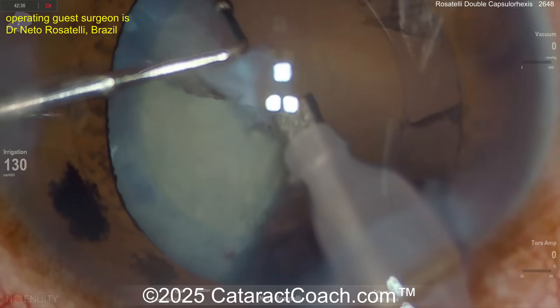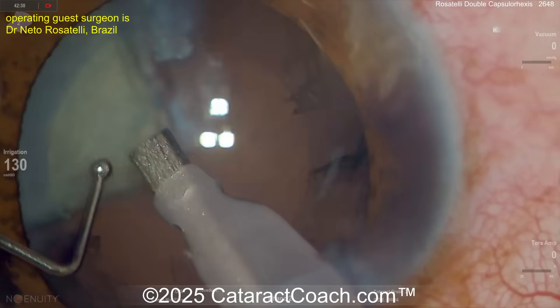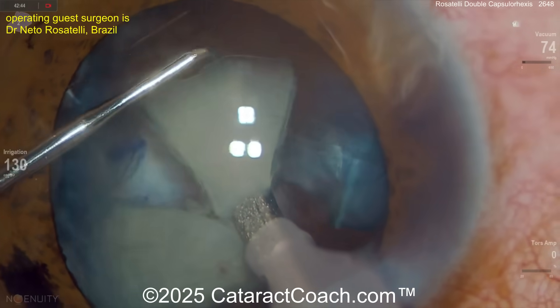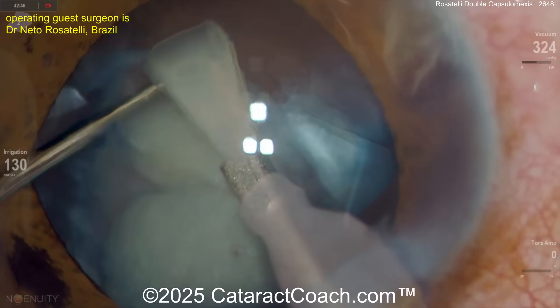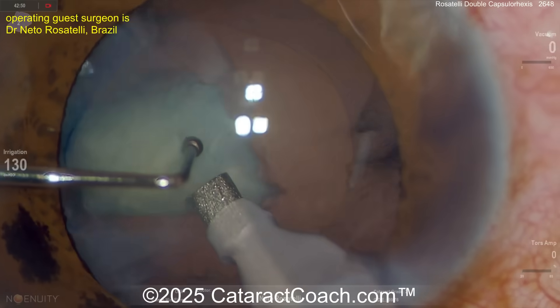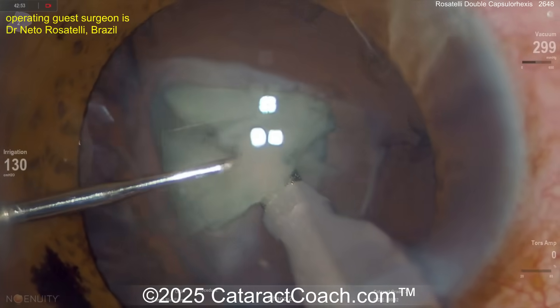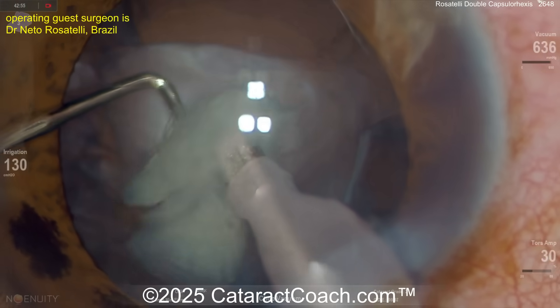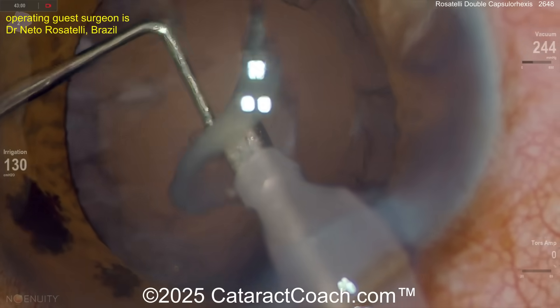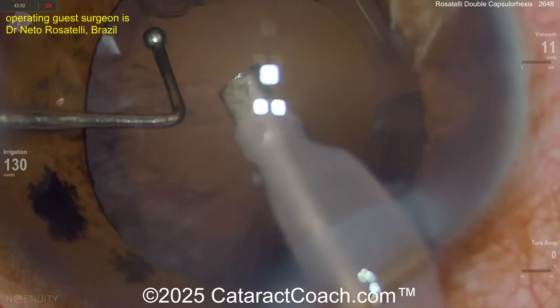Beautiful job, Netto. It's fun to watch a master at work. He is an incredible surgeon. Remember though — we do not compete with Netto. Netto is like Superman; we can't all be Superman. I can be an amazing, very talented surgeon, but I can't be Superman. So learn from Netto, try to pick up some of his techniques, but don't worry — you don't have to compete with him.